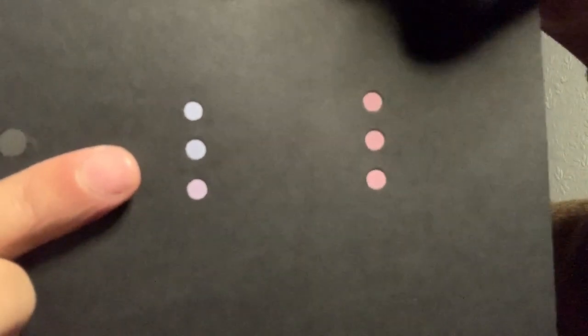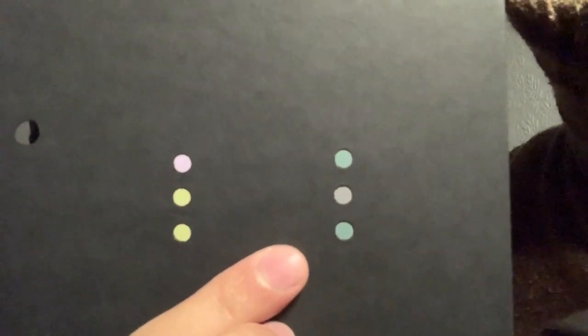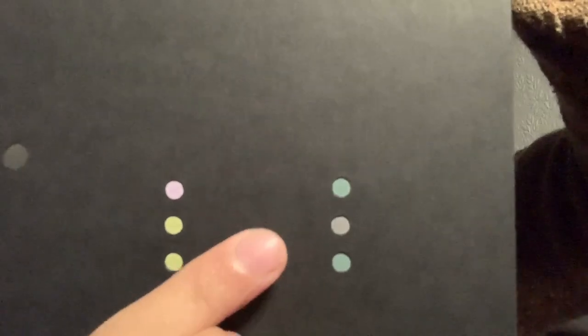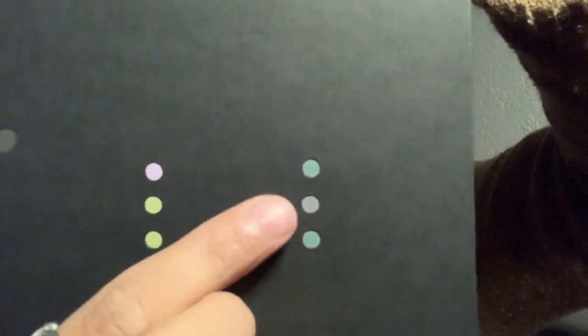The final plate of the screening part, plate number four: the answer for normals is the bottom is different. For the next spot, normal should answer that the shades all appear the same. For the following spot, tritons may miss this one, but normals should answer the top. For the final one, normal colour vision individuals should answer that the middle is their selection, but with a red-green defect you may miss this one.